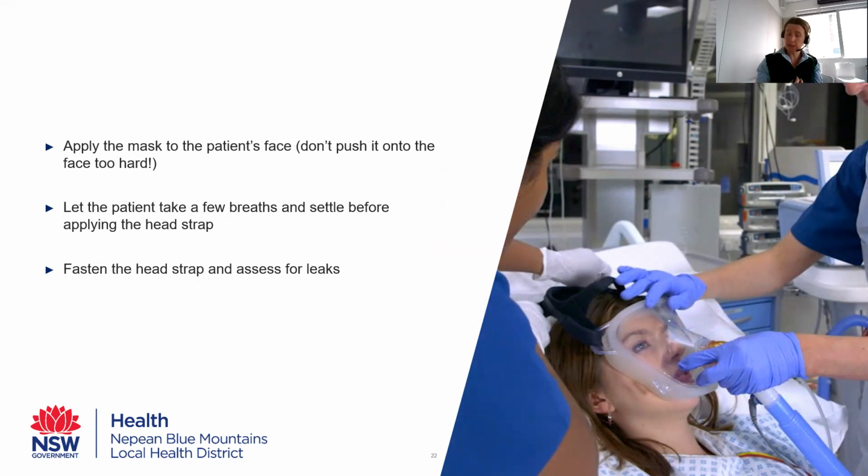In my personal practice, this is not set in stone, but I generally hold the mask with my hand until the patient is settled. So again, for some patients, that's 5 or 10 breaths. For some patients, that's 5 or 10 minutes. And I've found over my years of clinical practice that this actually just gives the patients a sense of comfort and confidence that if it's too much, they can just pull your hand away straight away and the mask will come off. It takes a little while for the patient to get used to the feeling of all of this air blowing in their face and to start working with the machine.